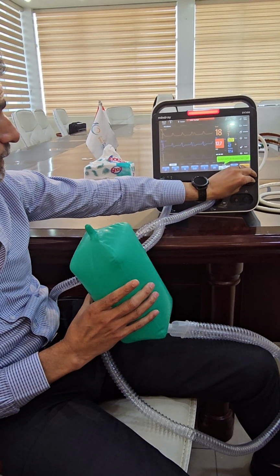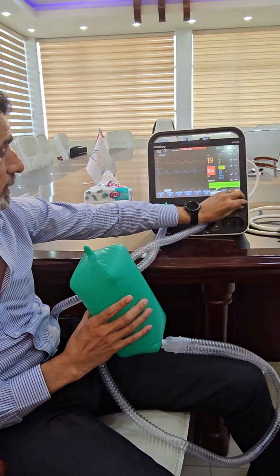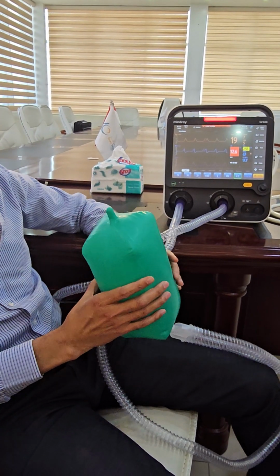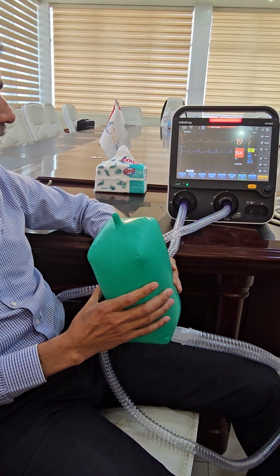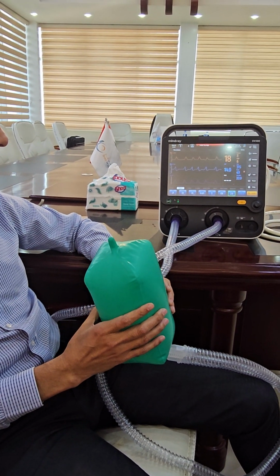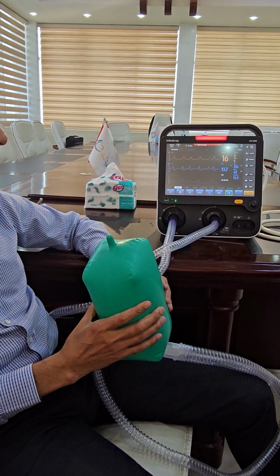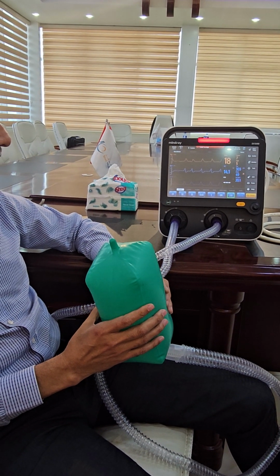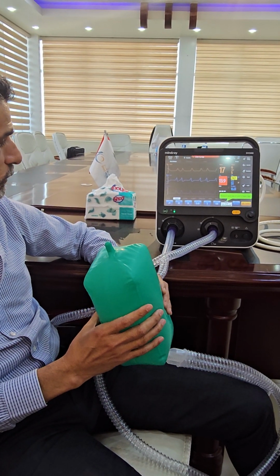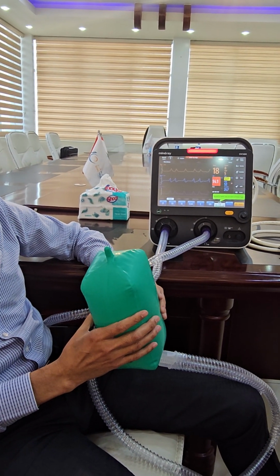So let's make the trigger bigger, make it 2. Now let's make it smaller. See, now whatever I do, it will give, even if it's very simple.